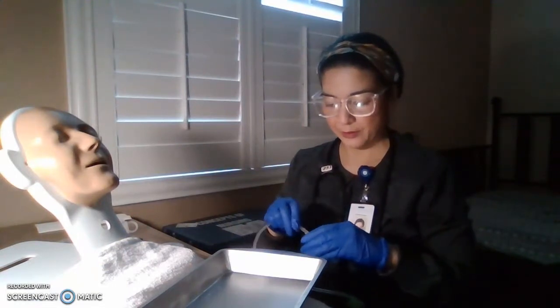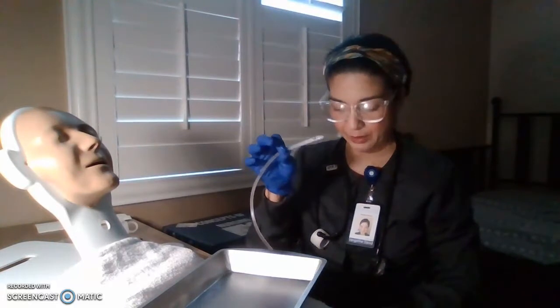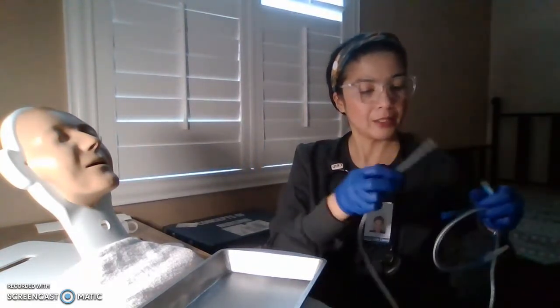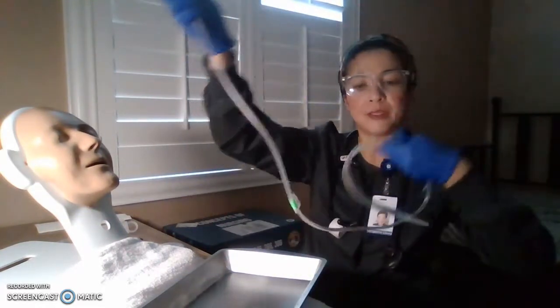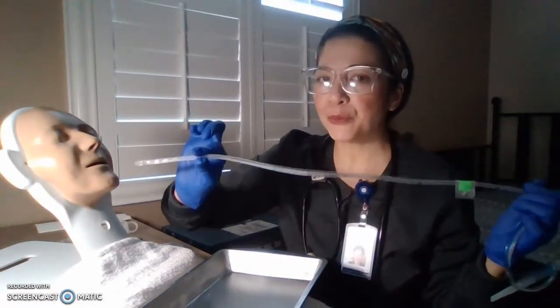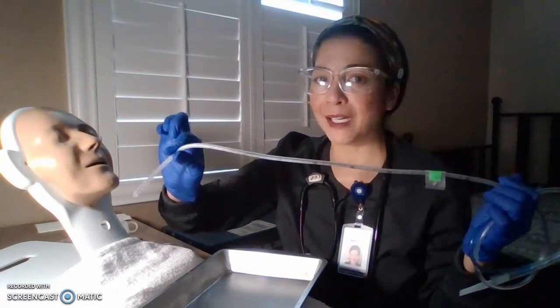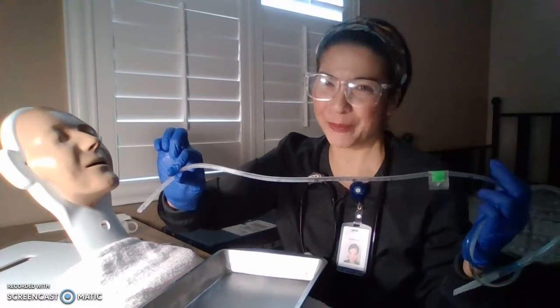All right. I'm just lubricating the end, okay? All right, once we're done with that, we will now do the insertion. Okay, so anatomy wise, how do we go in? It would be going straight and down, not up, straight and down. Okay, that's how we're made.